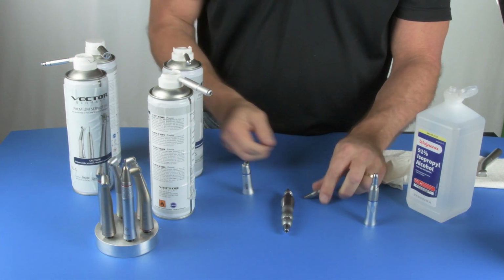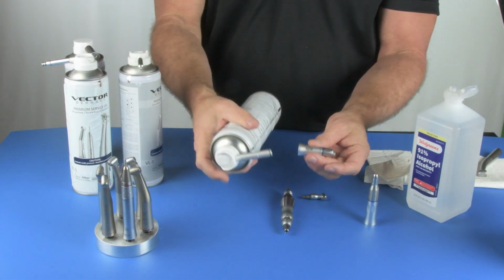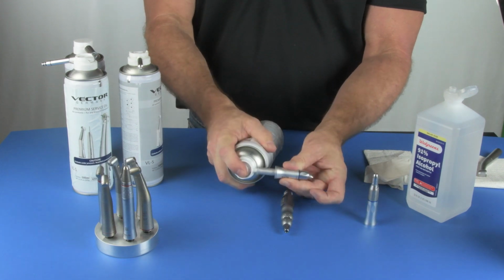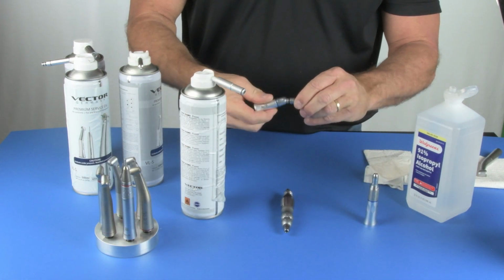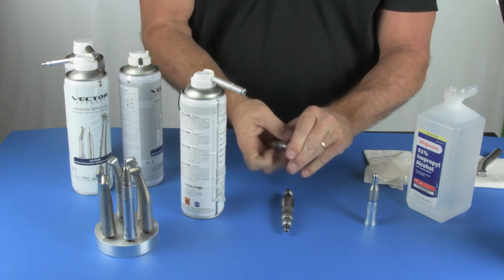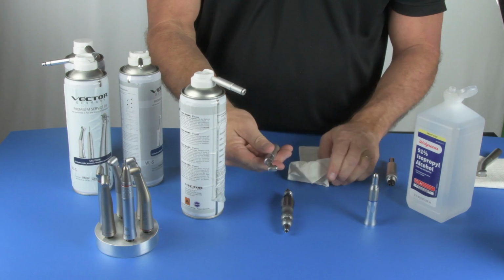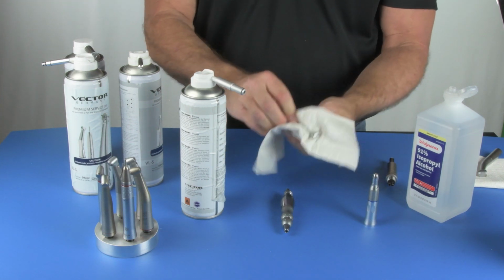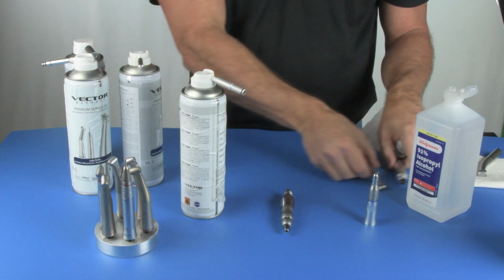like so. Take the E-type portion or the contra-angle portion and use your E-type adapter and spray it for 2 seconds. Reassemble. Because these are gear driven, it is not necessary to run these. So these can simply be wiped off with the alcohol 2x2 and they are ready for sterilization.